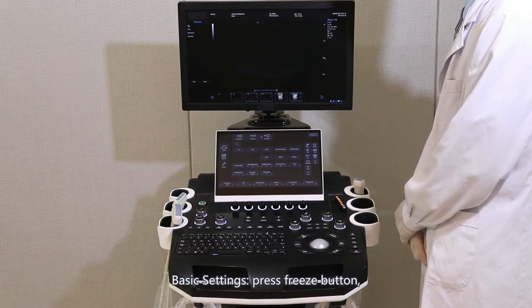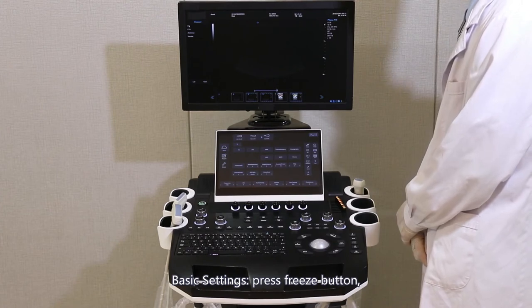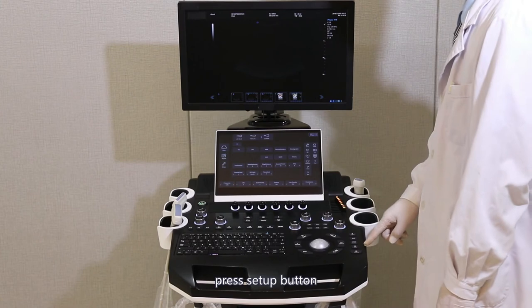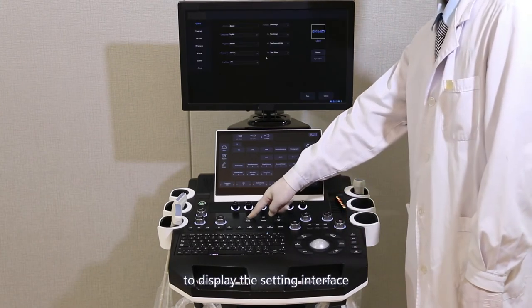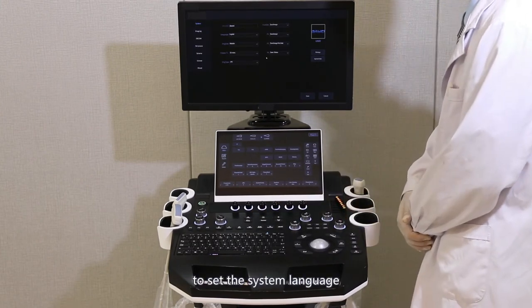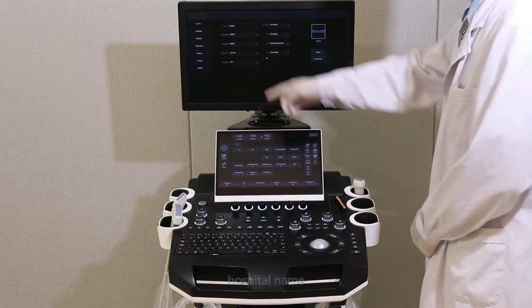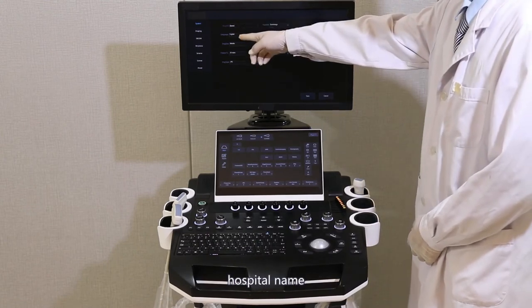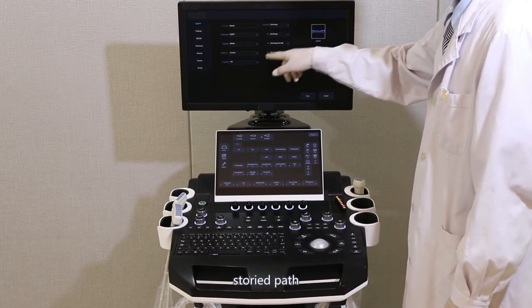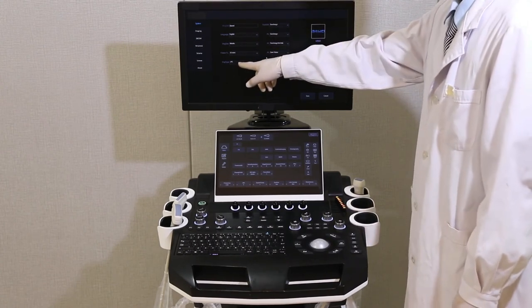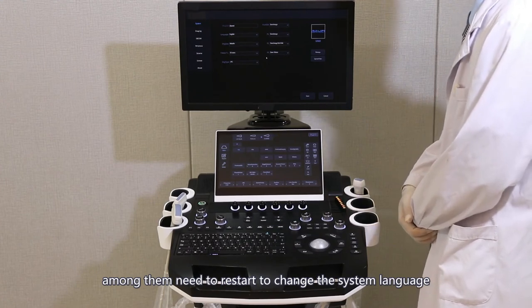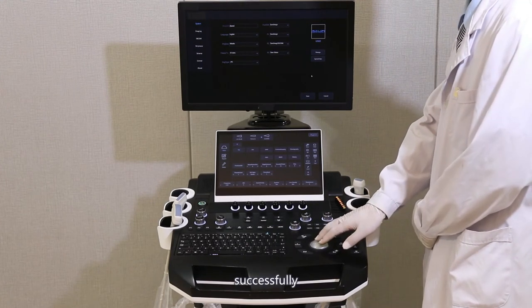Basic settings: press the freeze button, then press the set up button to display the setting interface and set the system language, hospital name, storage format, storage path, and so on. Note that a restart is needed to change the system language successfully.